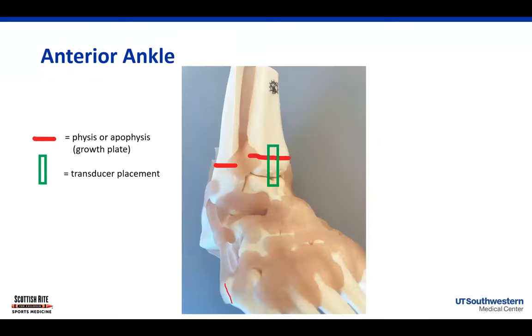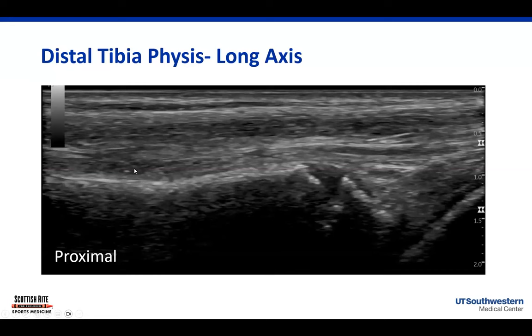Starting on the anterior ankle, I place my transducer over the anterior ankle. The green box shows transducer placement, and the red lines represent a physis or apophysis that we'll see in this skeletally immature patient. Here we have a picture of the distal tibia with a nice smooth bony cortex. At the very distal end, this is the distal tibia physis - don't mistake that for a fracture. We don't see any hematomas around it. You always have to scan medial and lateral along the entire tibia to make sure there are no breaks in the cortex or hematomas that would suggest a distal tibia fracture. We don't see any of that in our patient.